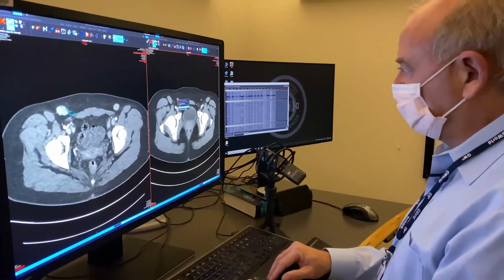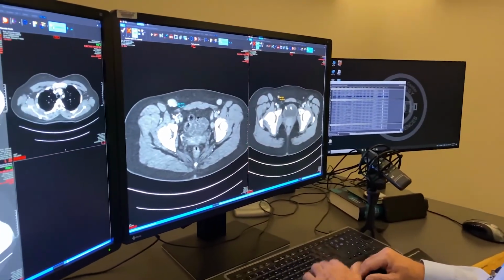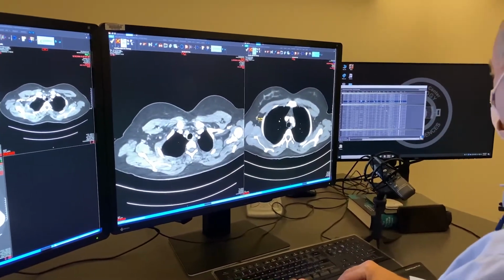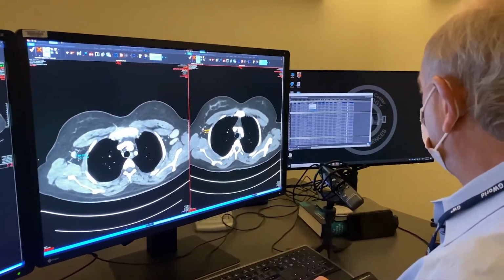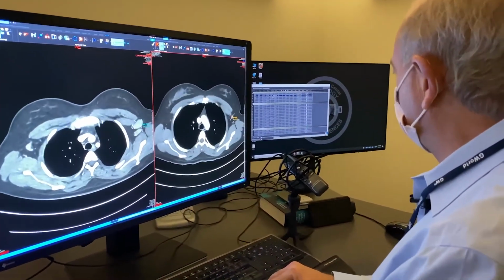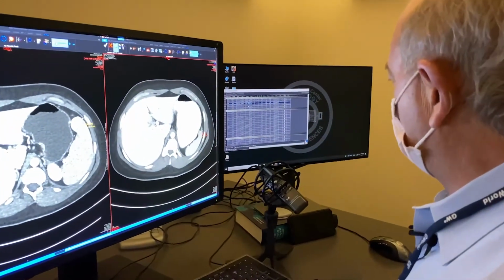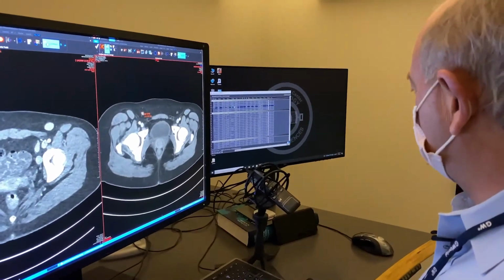Then to compare these, this puts it into the data. So every time we're jumping to a different part of the bookmark list. Then if these are targets, each one that's specified, then I can take these and make them into targets. And this is done by the oncologist. And this is the tumor part, the tumor measurement, the clinical trials part of the study.